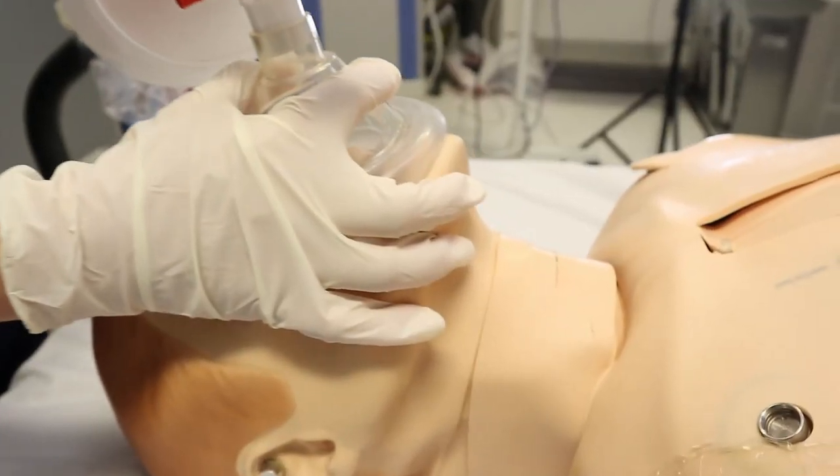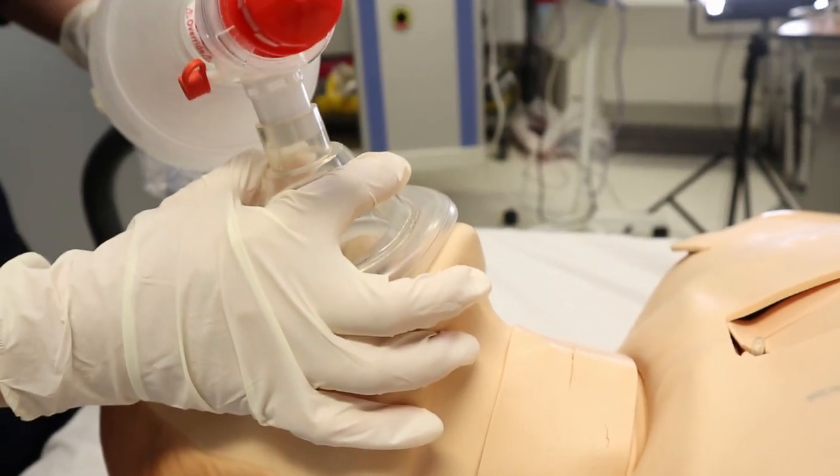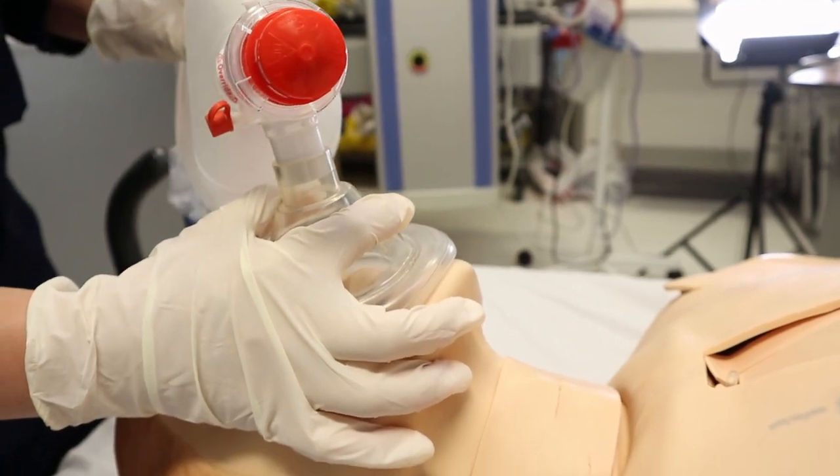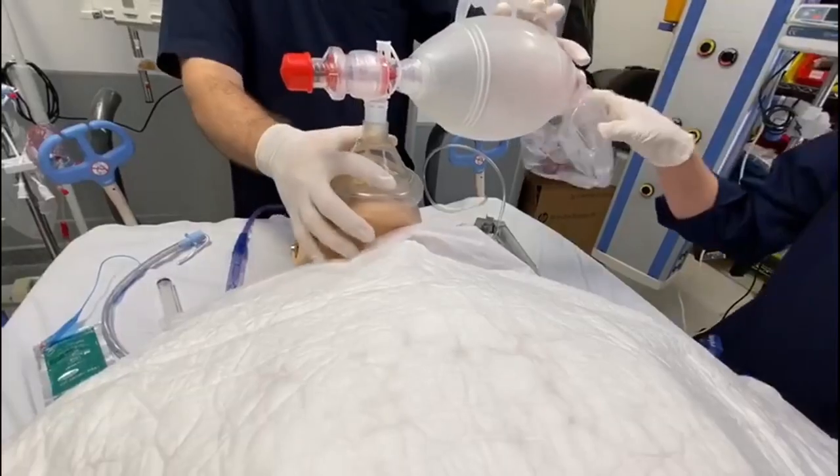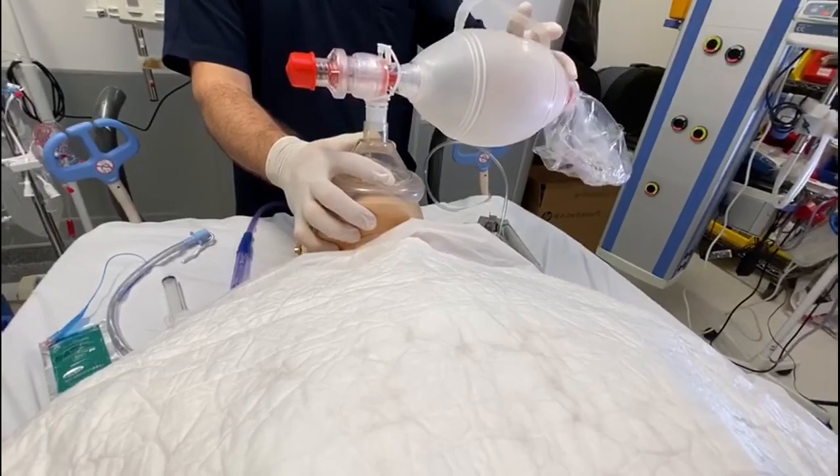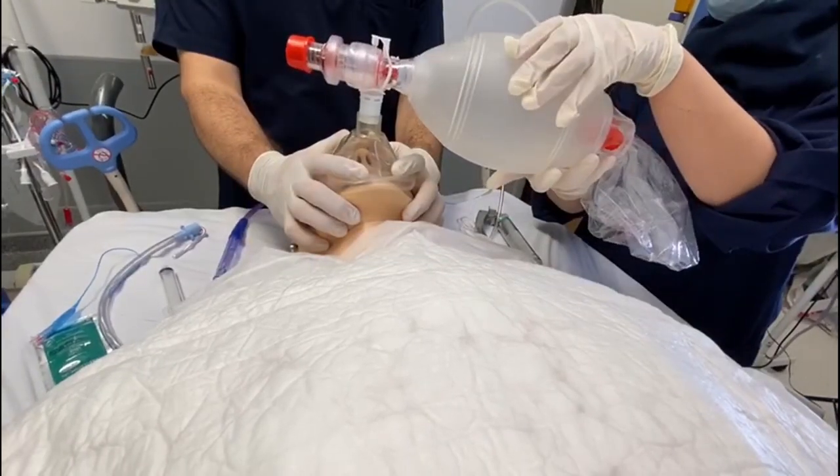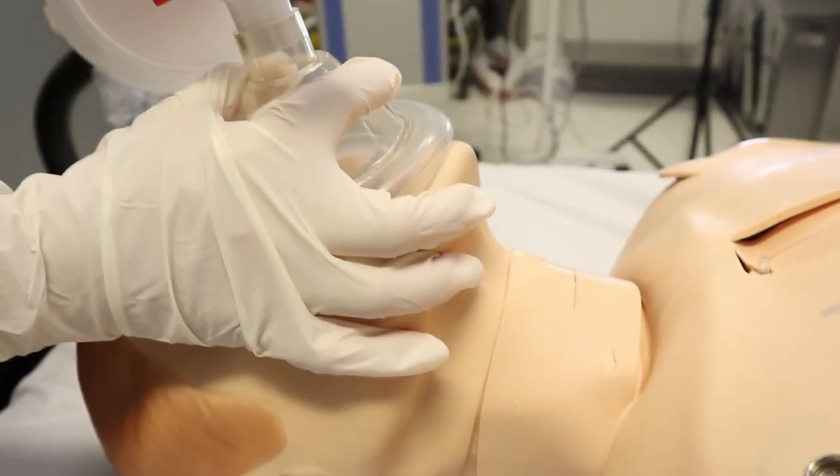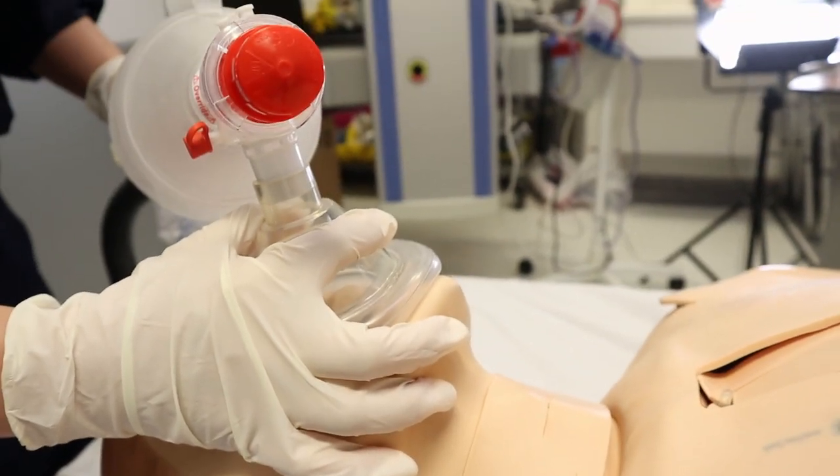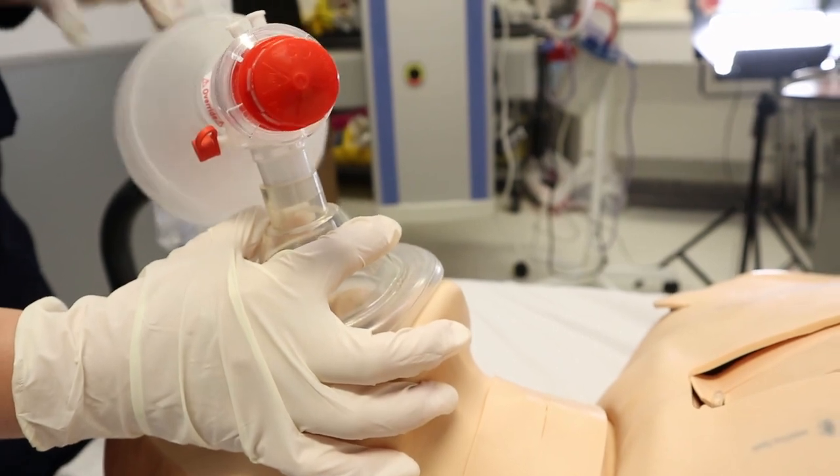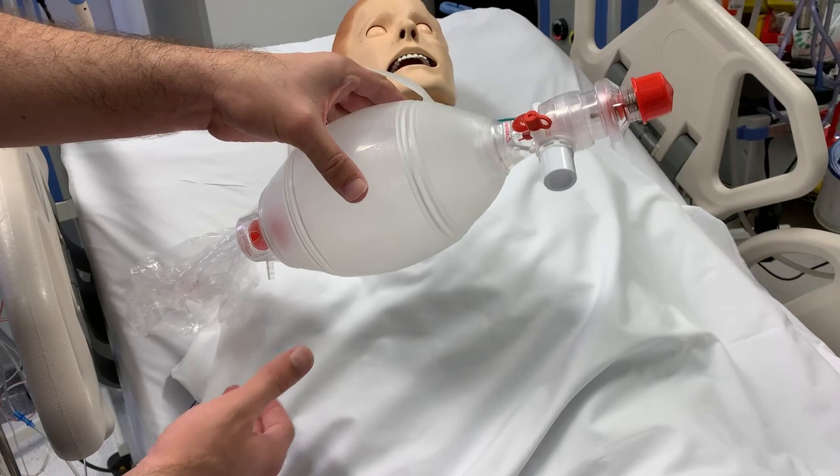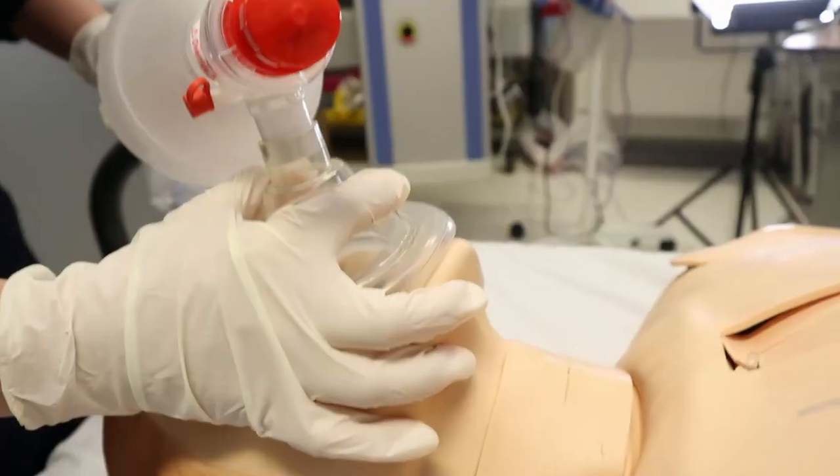We really need to make sure that we are firmly pressing by C and E technique. If the sealing did not achieve by one hand, you might need to use two hands and you need another person to squeeze the bag. So you will put like double C and double E technique. Squeezing for the bag should be gently over one second, so do not make it too fast and do not make it too slow. Avoid high peak pressure, avoid high volume, avoid rapid inflation.